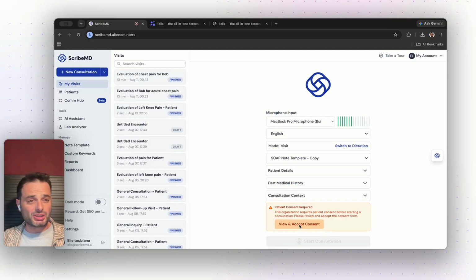If the patient has follow-up questions specifically about ScribeMD, you can tell them that the conversation is never recorded for more than 15 days. So after 15 days, everything is fully deleted. And also, depending on your location, the data is going to be fully encrypted and using the highest compliance standards, HIPAA in the US and different compliance programs in other jurisdictions.